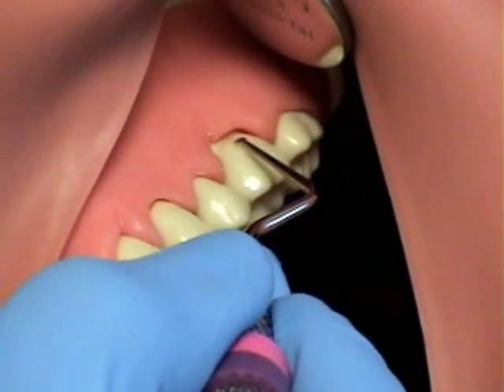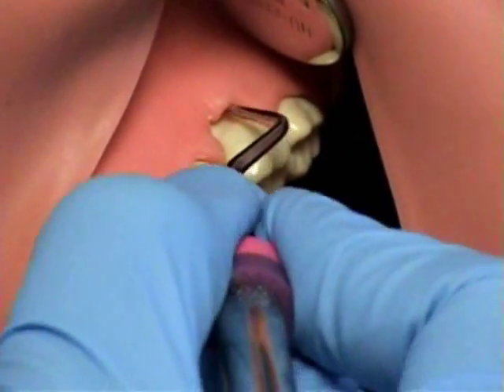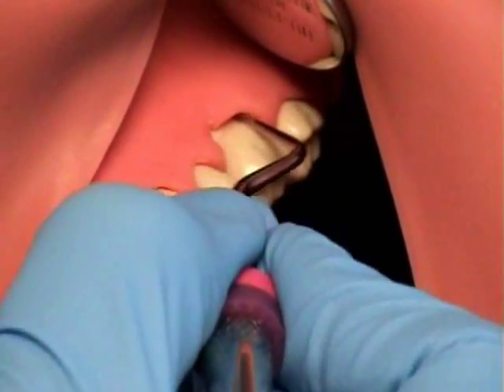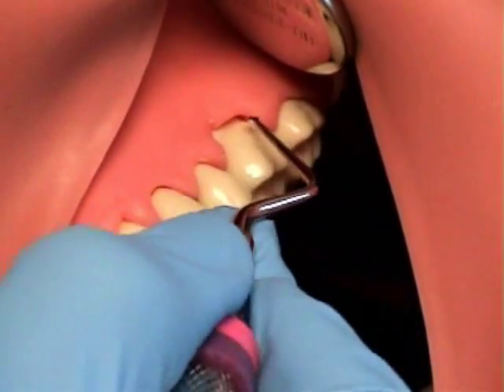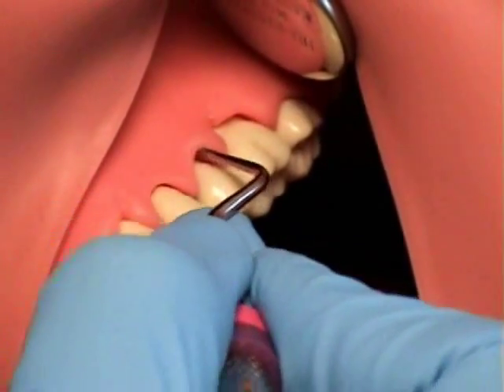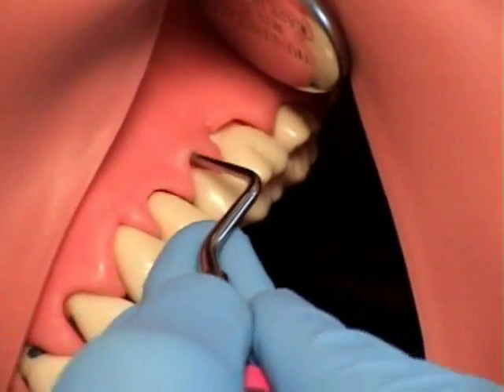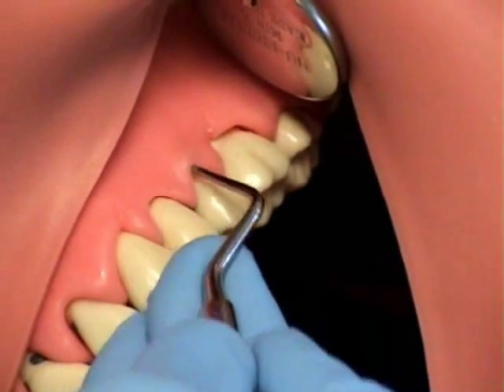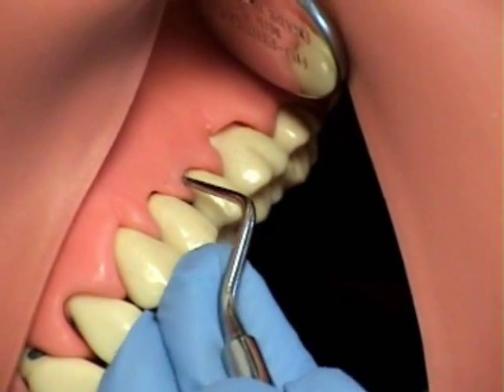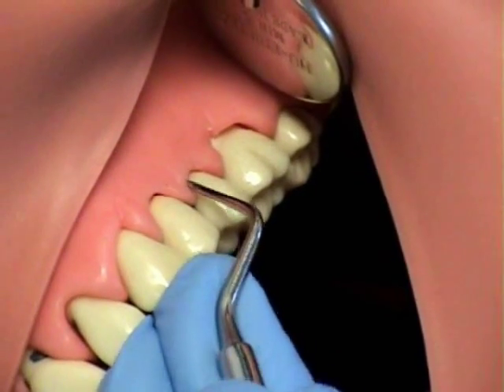The next advanced instrument is the O'Hara debridement curette. It is used to smooth root surfaces and remove small residual deposits after ultrasonic scaling. The tips look like a spoon excavator and are described as disc-shaped. The blade curves into the tooth for adaptation into furcations, developmental grooves, and line angles. The entire rim of the blade serves as a cutting edge. The blade design enables a push or a pull stroke in all directions.